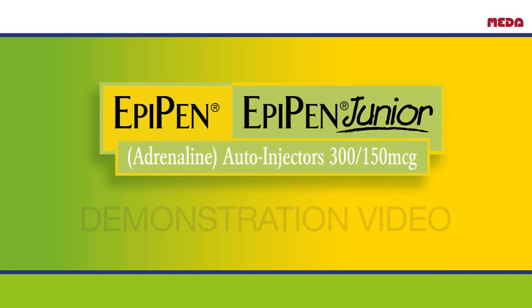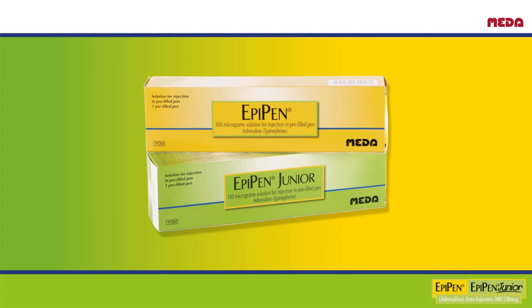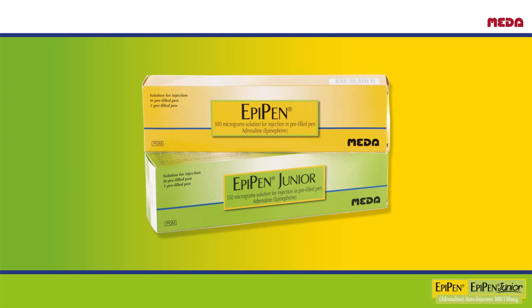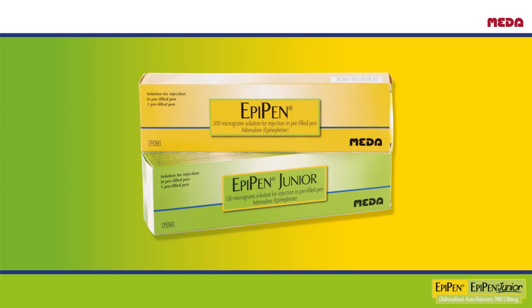Hello and welcome to this EpiPen Adrenaline Auto Injector Training. This video will show you the main features of EpiPen and how to correctly administer it. It will also teach you how to practice with your EpiPen Trainer Pen. Watch this training often and show it to family, friends, and anyone else who may need to administer your EpiPen. Try using your Trainer Pen when you watch this video so you know how to use your EpiPen in an emergency.